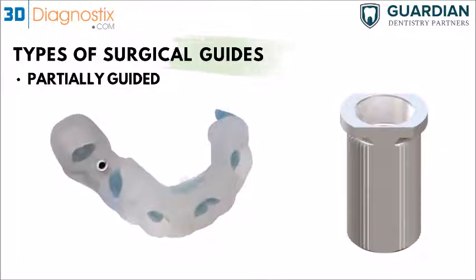So partially guided does not necessarily mean it has to be a pilot guide, but it's just a surgical template that would provide you with certain guidance, but it's missing one of them. So it's either sequential drilling, depth control, or implant placement in the end. So this is just an example that it could be just a pilot guide where you use the pilot or initial drill to drill the osteotomy and then remove the guide and continue freehand.